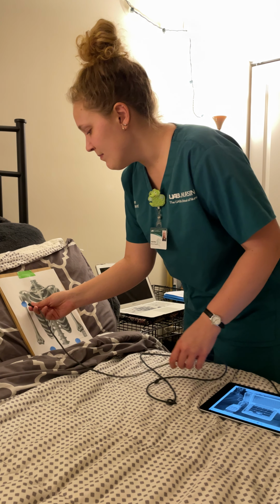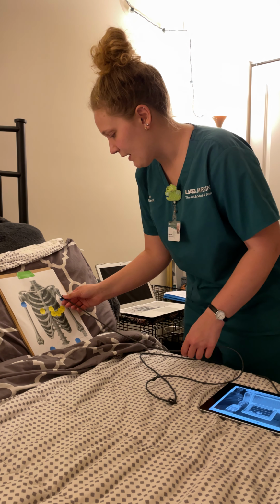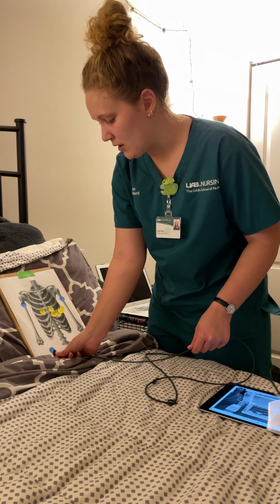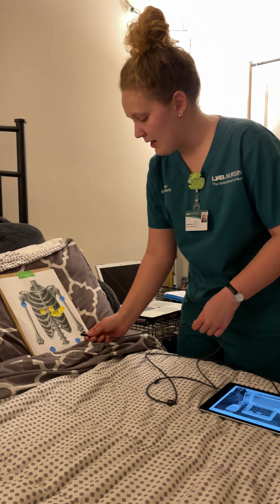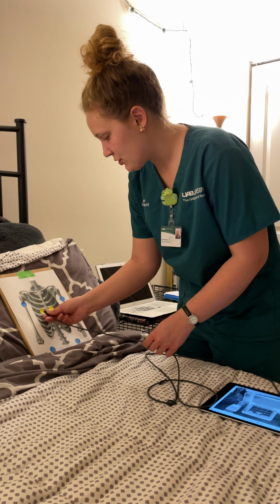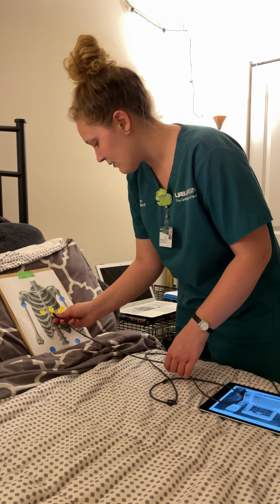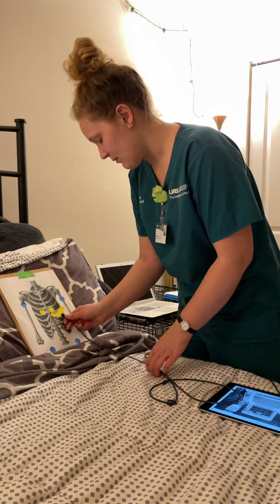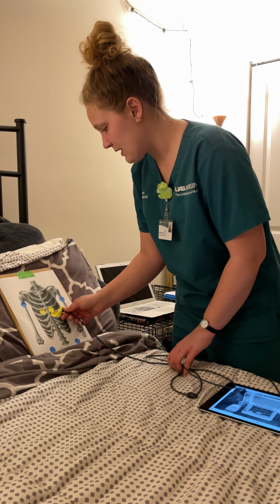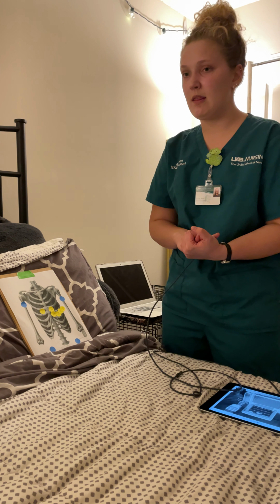So I will do the right upper extremity, and then the left upper extremity, and then I'll do the right lower extremity, and then the left lower extremity, and then I will attach V1, V2, V3, V4, V5, and V6.